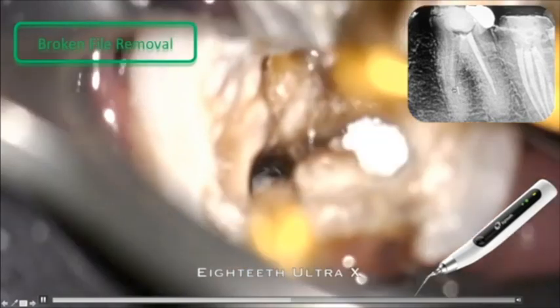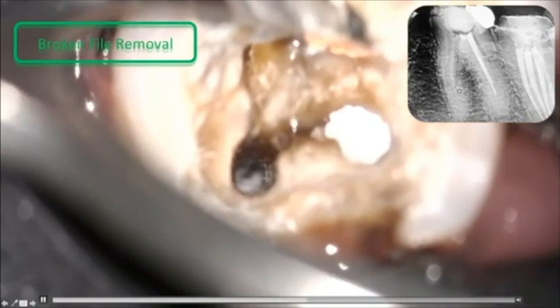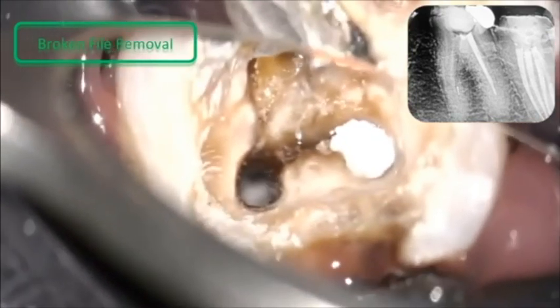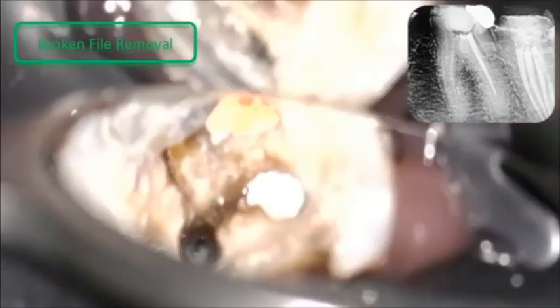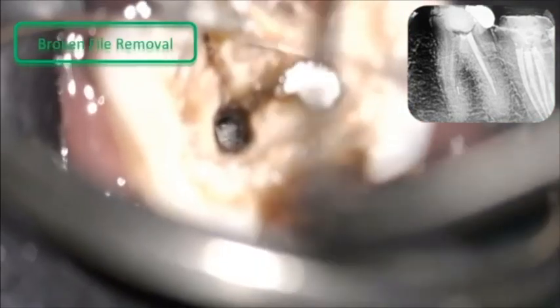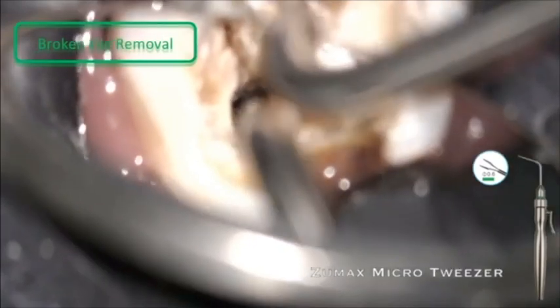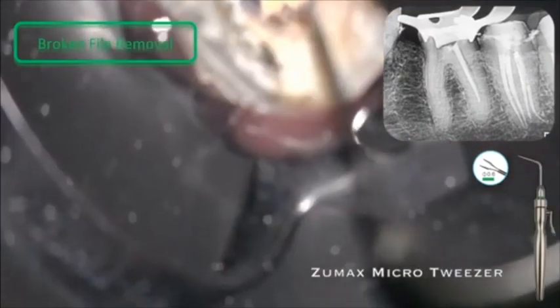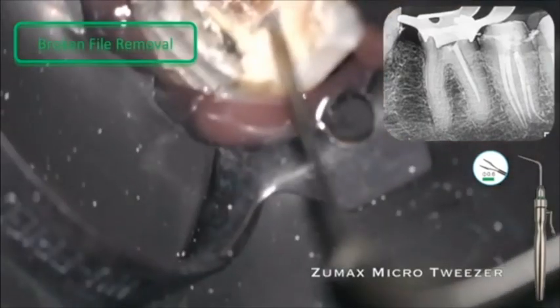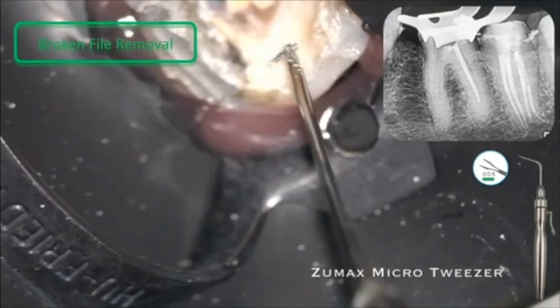It's a small piece. So this became from a medium case to an extremely difficult case. Here the visibility was minimal, but I was able to memorize the axis, so I tried to remove it and I just shoved it outside the canal, and now it's loose, and I'm taking the Zumax micro tweezer, and it's easy at the end. We catch it when it's loose with the micro tweezer, not when it's sticking inside the canal. So this is the retrieval.